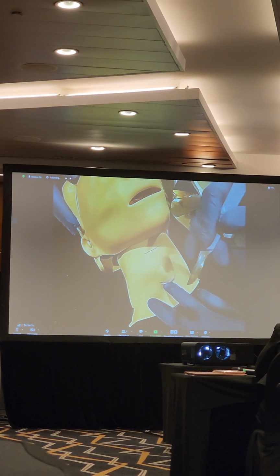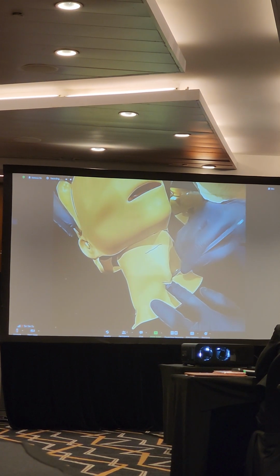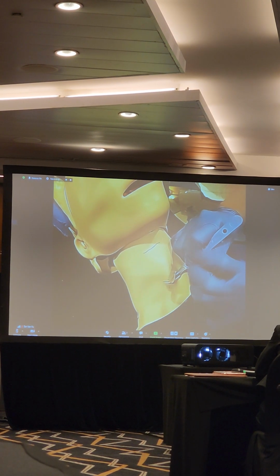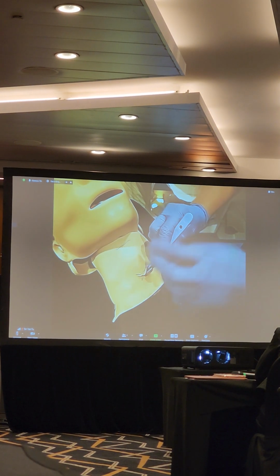So let me just show that to you. Don't do this. You're supposed to leave the blade inside and turn it towards the feet. If you put it this way, it's going to cut the vocal cords. So when you turn it this way, you pull this towards you, and you switch the hand. This is very important, and actually not very commonly mentioned. We assume you just cut and you can put in a bougie, but my question to you is how are you going to reach for the bougie?